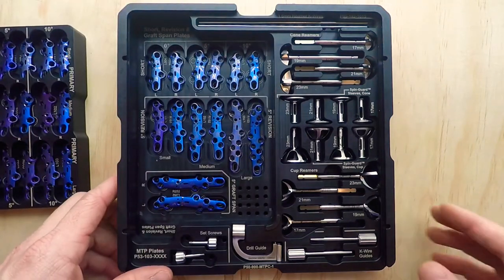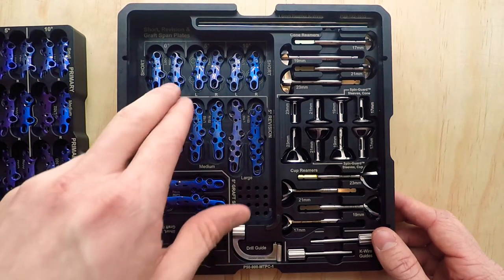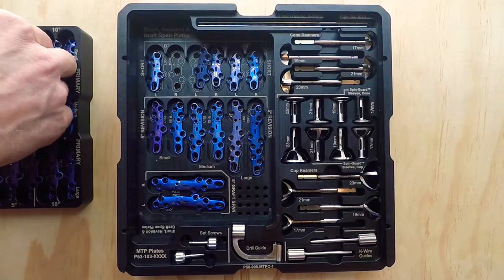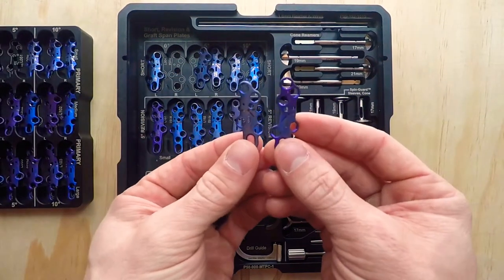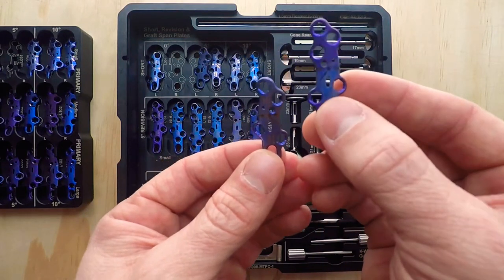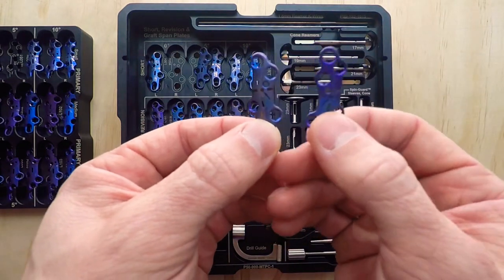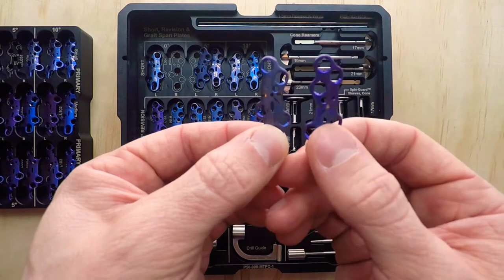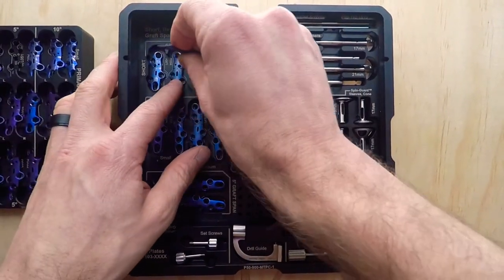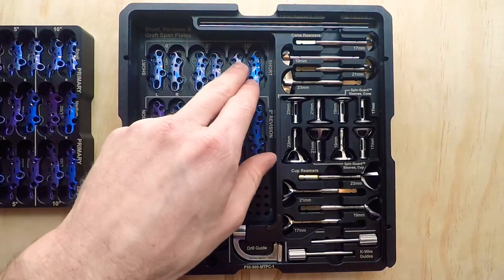If I remove this caddy, you'll see down below I have longer plates — these are revision plates, these are graft spanning plates. We listened to the field and what surgeons were seeing — issues they were running into with traditional MTP plates. This plate in my right hand has three holes on the distal cluster; the plate in my left hand has two holes. We simply clipped off that distal hole for patients with smaller anatomy where you run out of real estate for that distal screw. Those are also offered in 0, 5, and 10 degrees.